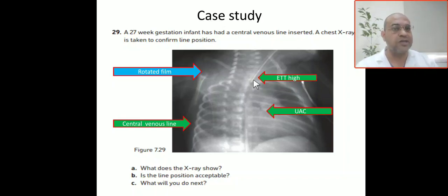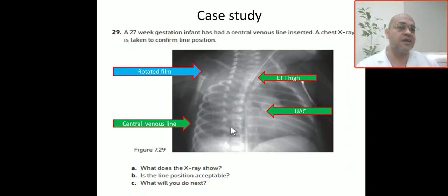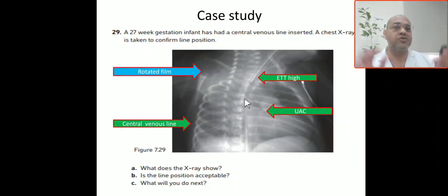So the film is rotated and the ETT is slightly high. Regarding the central venous line, it comes from the right side, then goes down. In the lateral aspect of the chest there is another line close to the vertebral column, which most probably is the UAC. That is the comment about the X-ray.